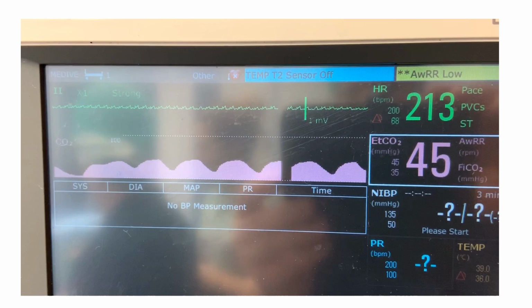Now, this patient was breathing quite noticeably. It had good thoracic movement, and we were giving it an assisted breath around about once every 10 to 15 seconds, I believe. CO2 is only going down to baseline when we give this patient an assisted breath. And what this means is the patient, when it was breathing for itself, was not clearing all of the CO2 out of its airway before it breathed back in again. And that patient was rebreathing.